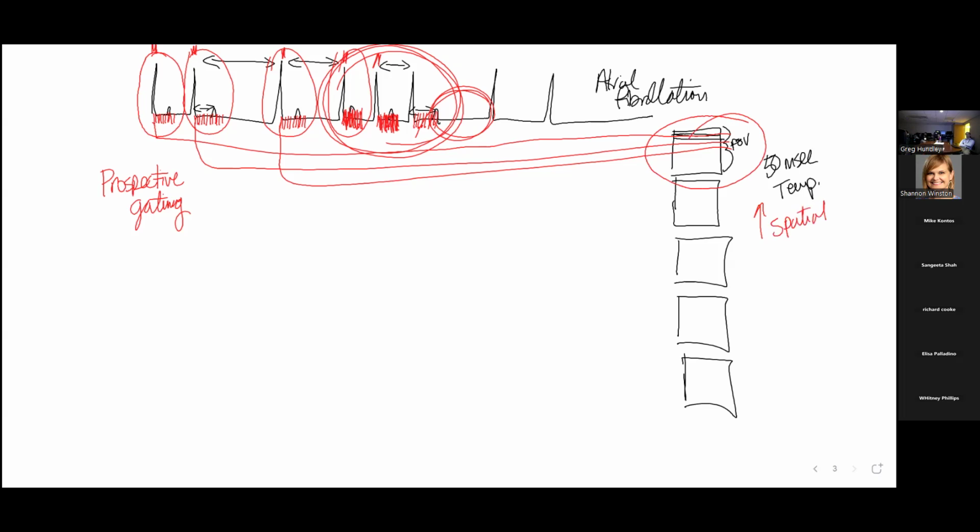And those really pretty pictures at a high temporal resolution with an adequate signal to noise. Okay? So if we get blurry images, we are wondering, are we seeing the triggers?